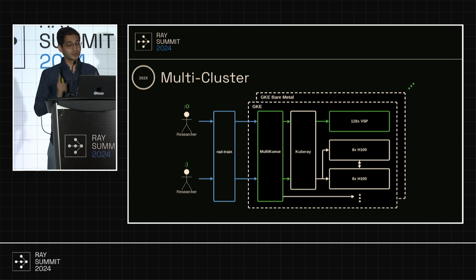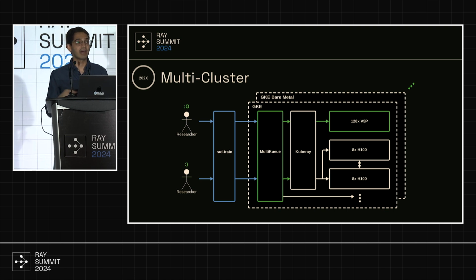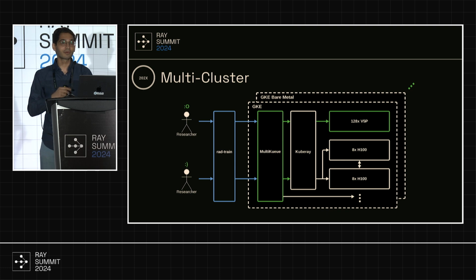Actually, this is super relevant to healthcare specifically because there are certain restrictions on where we can take PHI, personally identifiable health information, in the world. So for example, in Canada, if we're wanting to train a multimodal model on images, MRIs, X-rays, that's considered PHI, and we cannot train that model outside of Canada's borders. And because this is essentially a template to deploy Kubernetes into other regions, we can do exactly that. We can bring up an A100 cluster in Canada to train that multimodal model. And that's true for other countries as well.